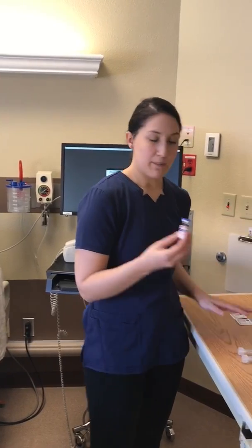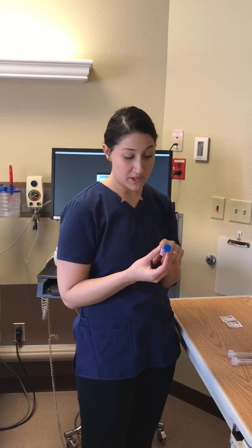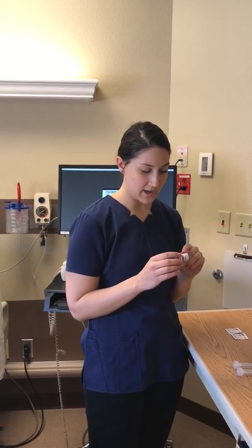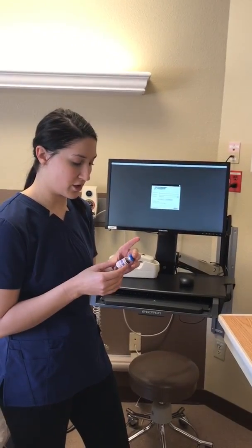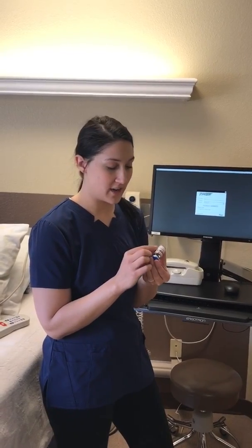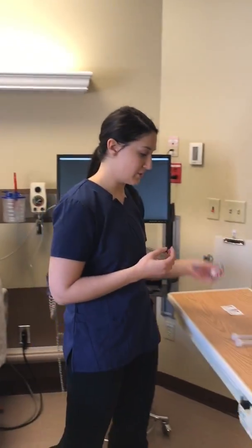So the first thing I'm going to do is withdraw the medication that I need, the vial, and then I'm going to check that there are no particulates in here. The vial is not cracked or there's nothing wrong with it. The date is still accurate, so 4/2027, which still works, and I'm going to make sure that is accurate with the MAR. Make sure that that's all correct, and it is a multi-dose vial, so I'm going to go ahead and put my initials and the date on it because I am going to draw that up today, and it will be the first time it's used.